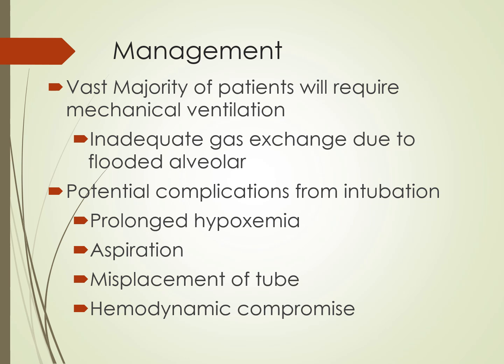And sometimes when a patient's on mechanical ventilation, who's in ARDS, there's a hemodynamic compromise. So sometimes you have to do some fluid administration to keep the blood pressure up. And these are very important steps. Also, when you use high levels of PEEP, you actually decrease cardiac output, and this potentially could be another problem.